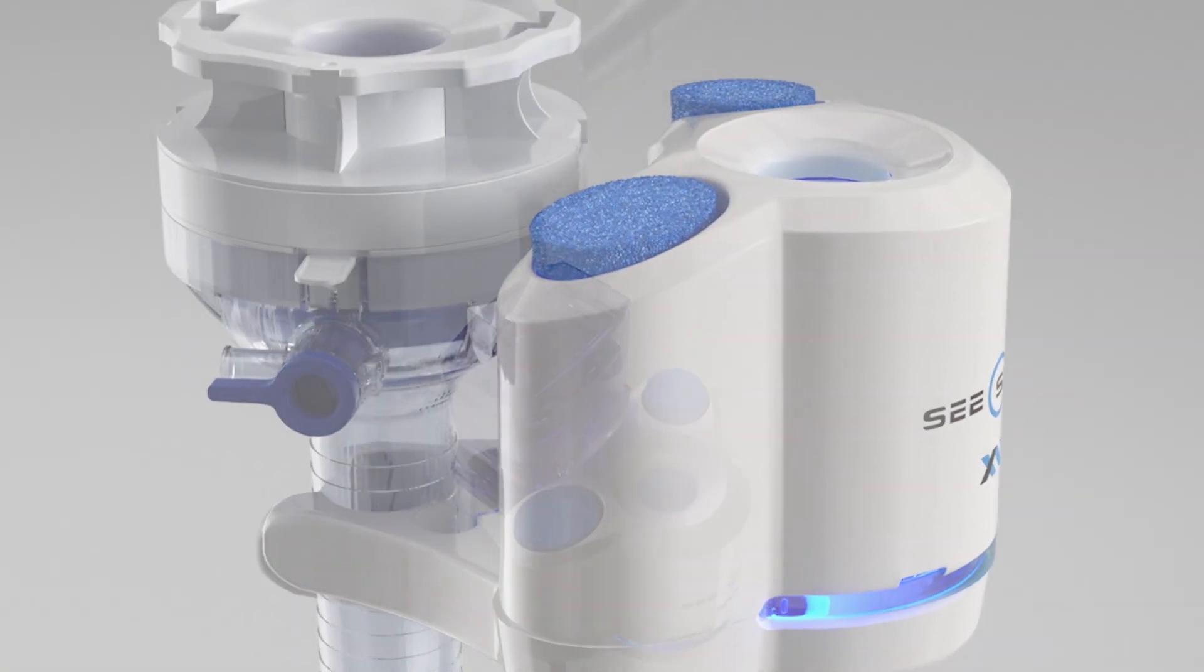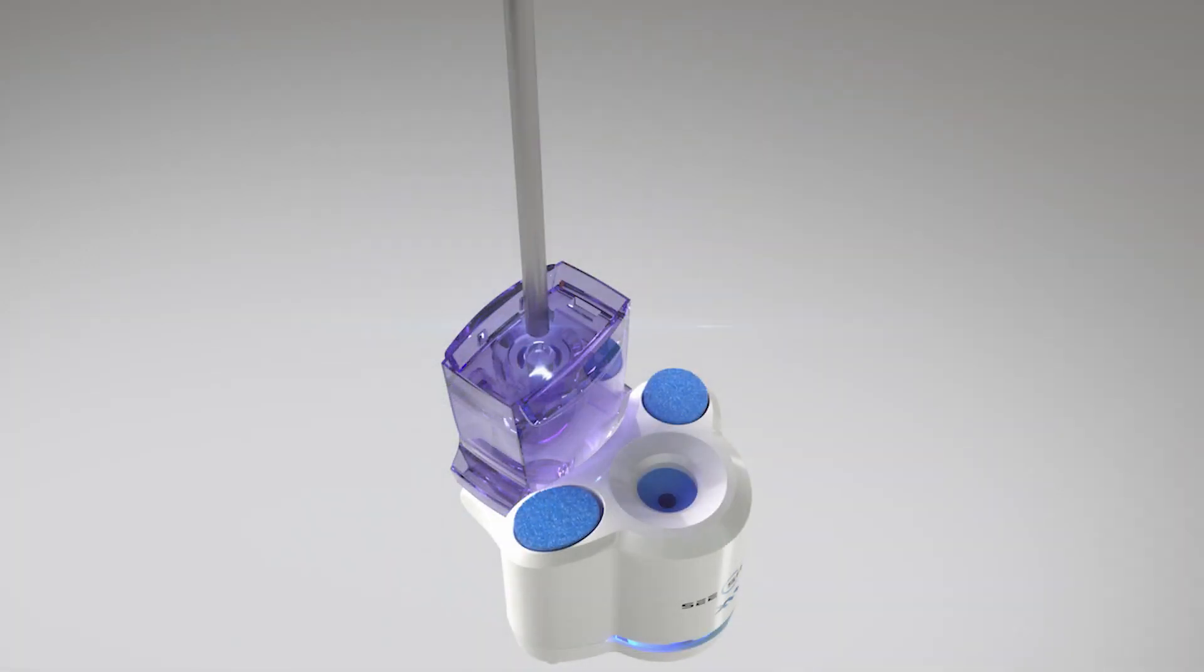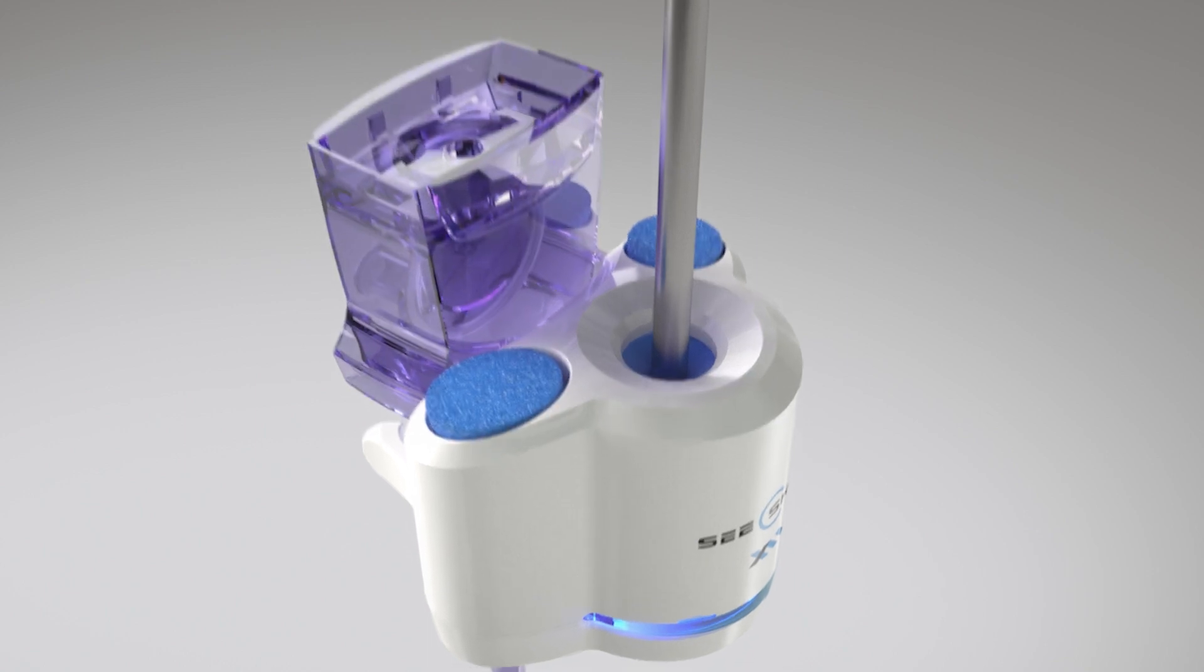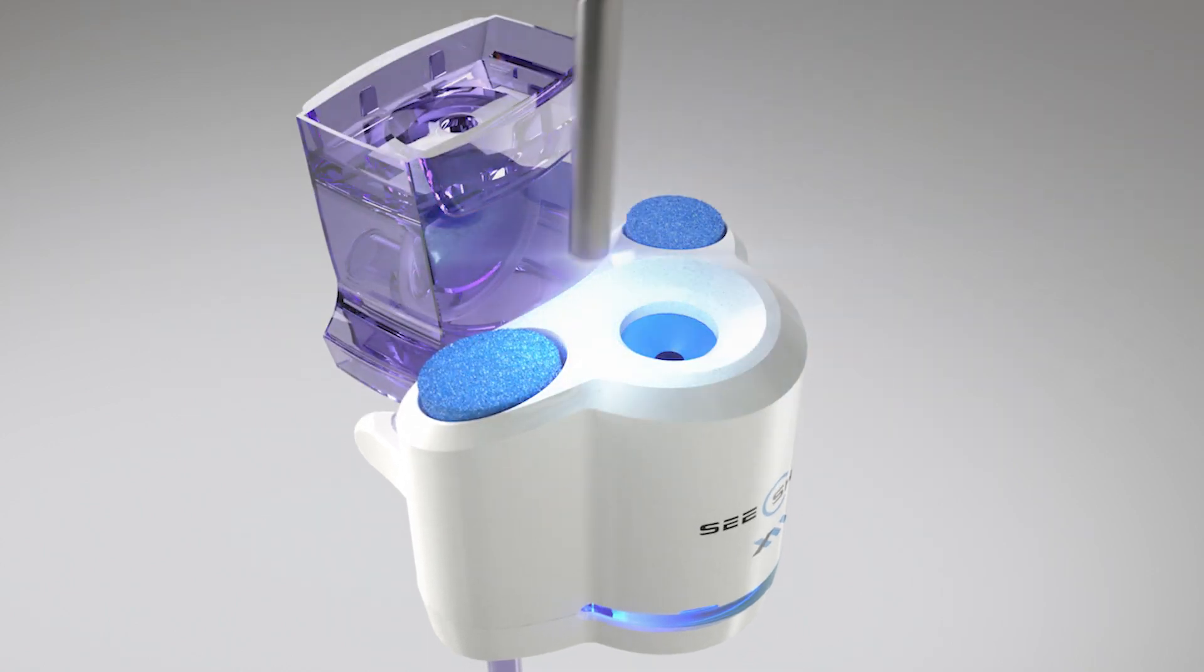When attached directly to a trocar, the C-Sharp enhances control and efficiency by allowing the clinician to retract a laparoscope, clean, defog, and return it to service in one streamlined process.